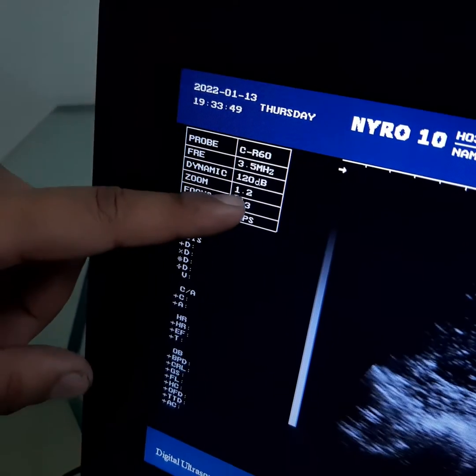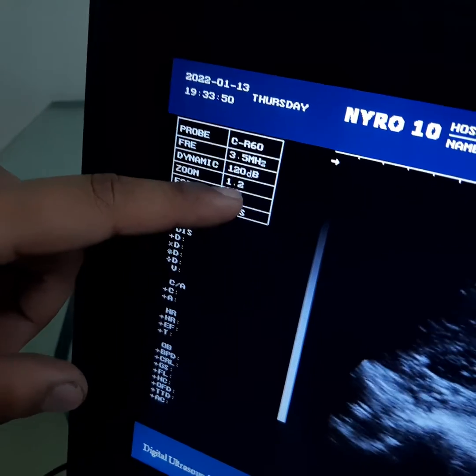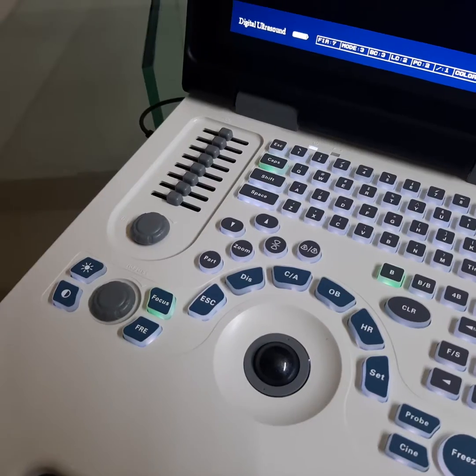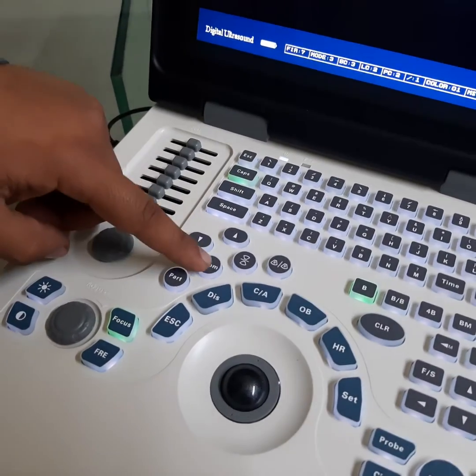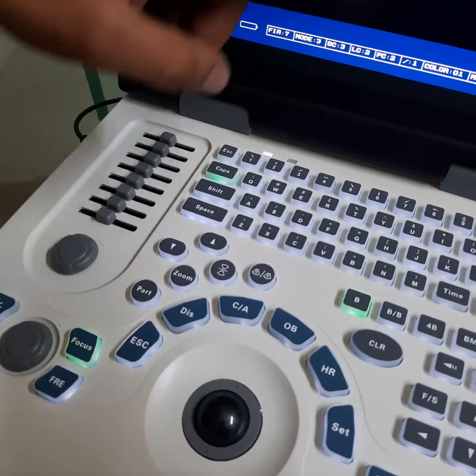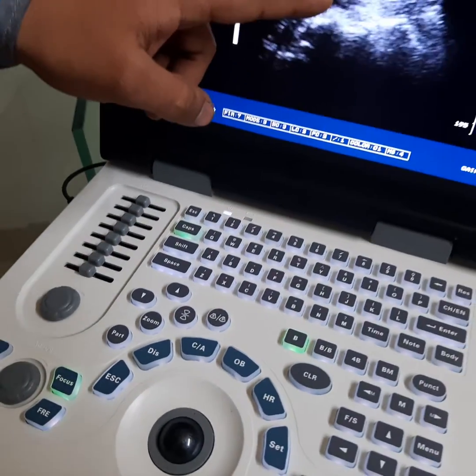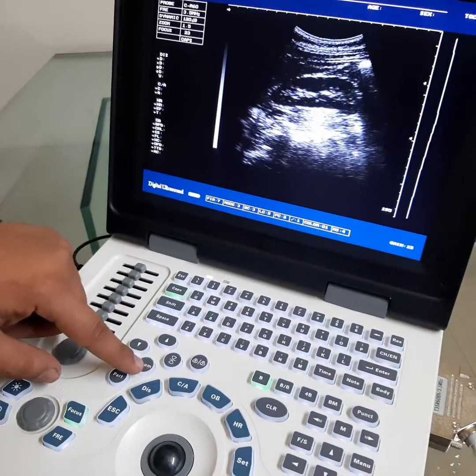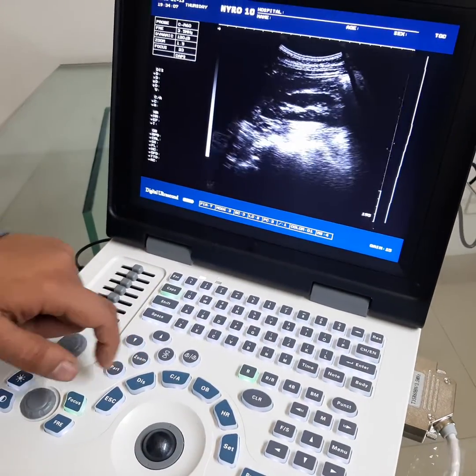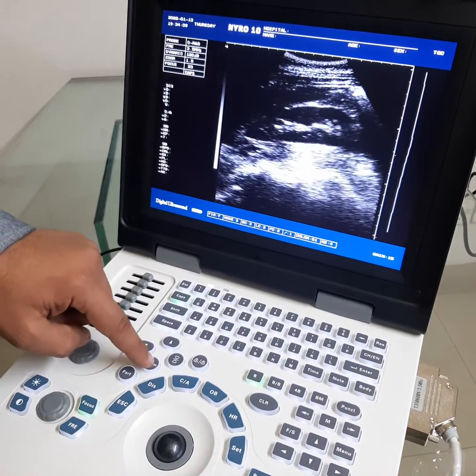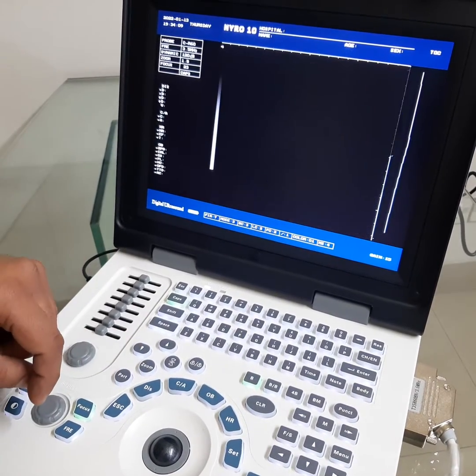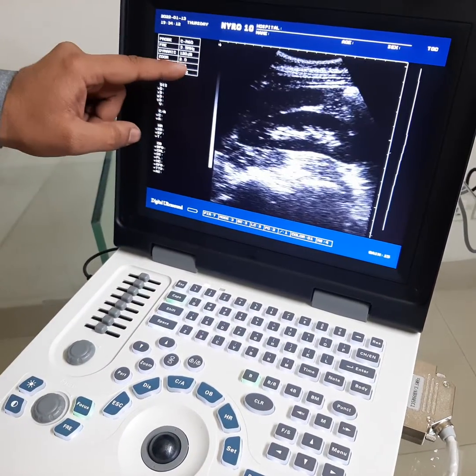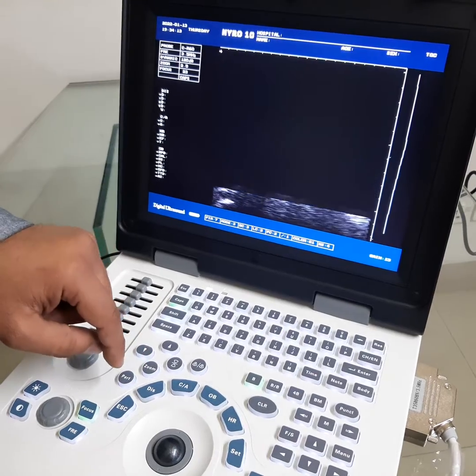Zoom 1.2. To change the zoom, press again. Zoom value is higher, now it's 2.0. Press again, 2.8. Now decreased, this is the normal value, 1.2.